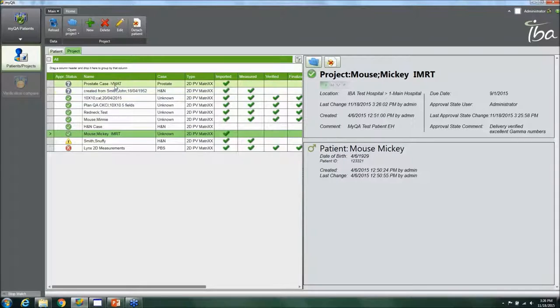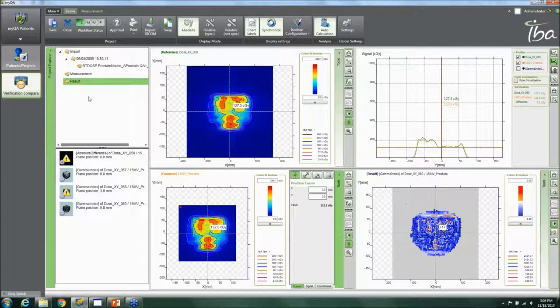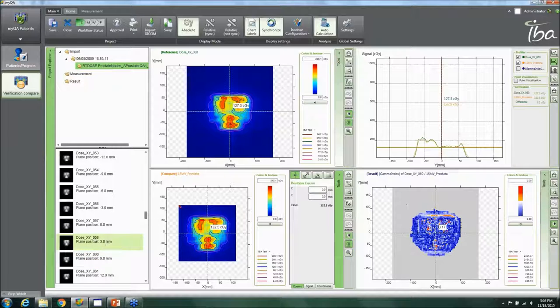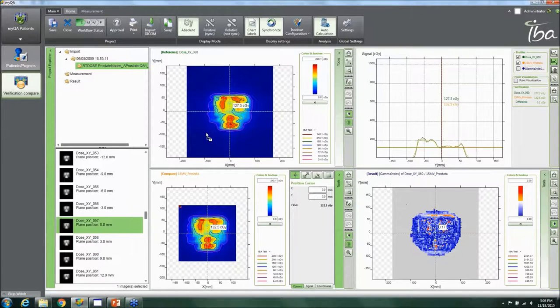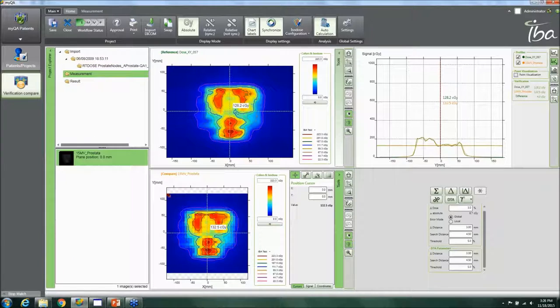Opening a VMAT plan — for example, a prostate case — the DICOM plane has already been imported. You look for which plane you want, drag in the zero-degree plane to check if it's the correct one, and bring in the corresponding measurement plane. A quick gamma calculation is then performed.